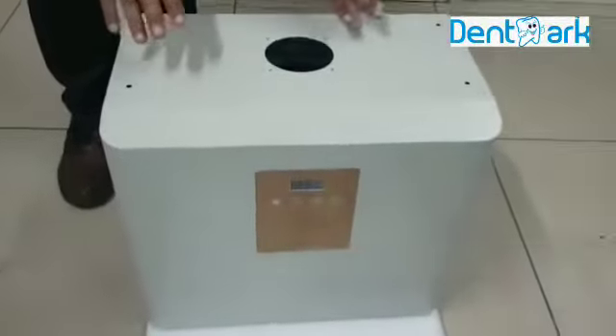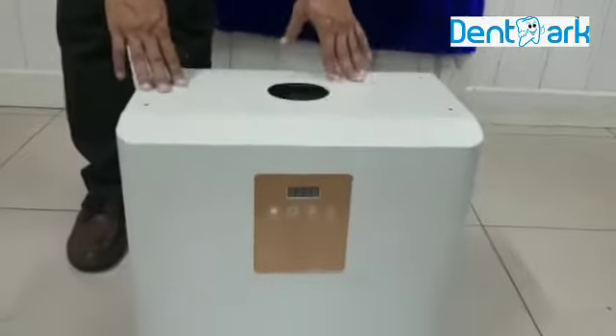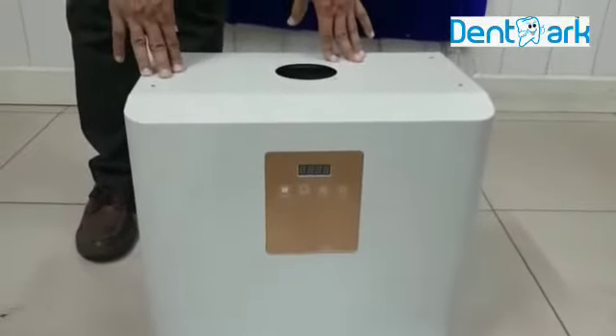First of all I will tell you how to fix the machine. After that I will show you the working.